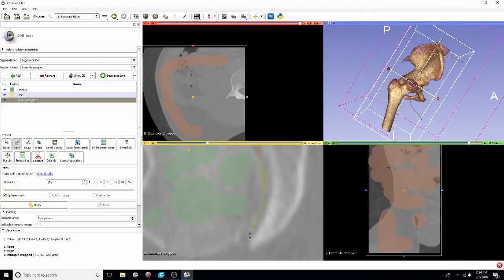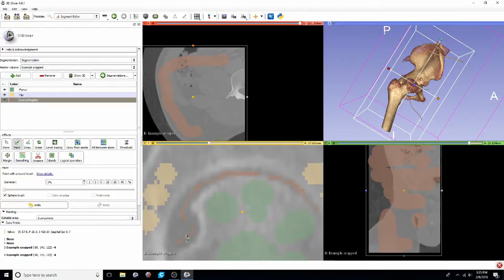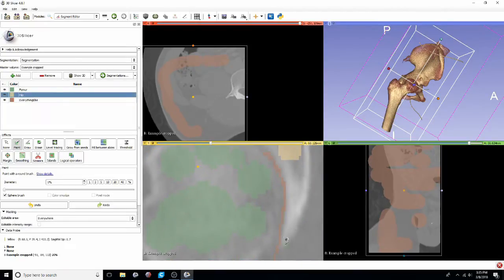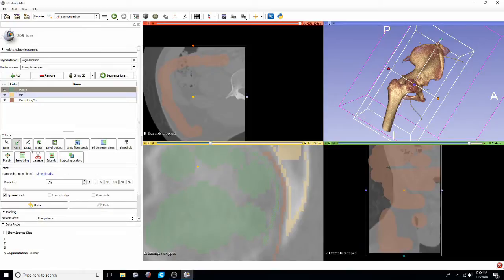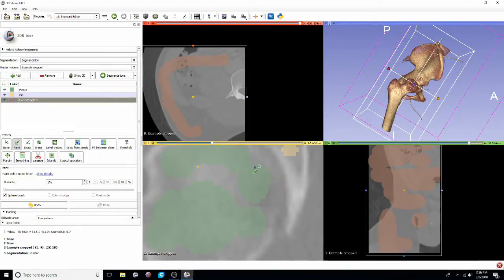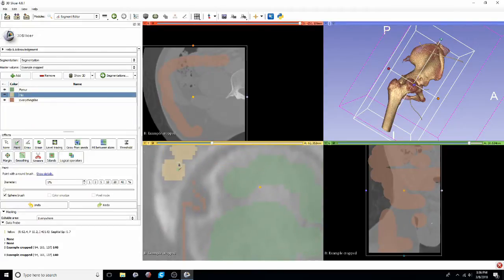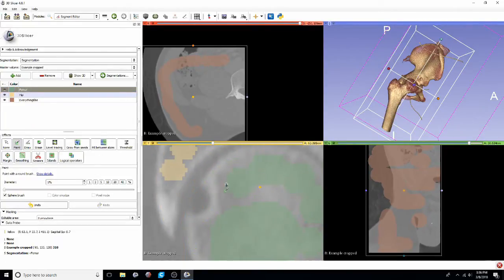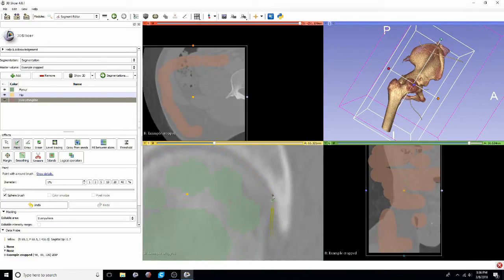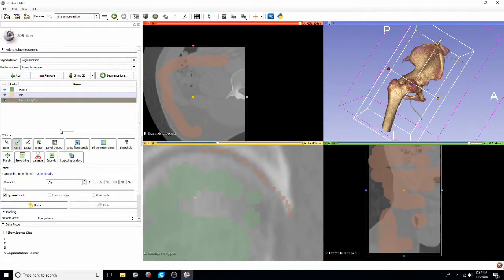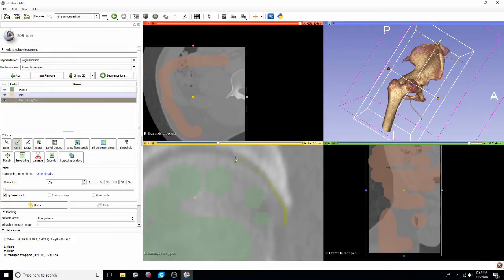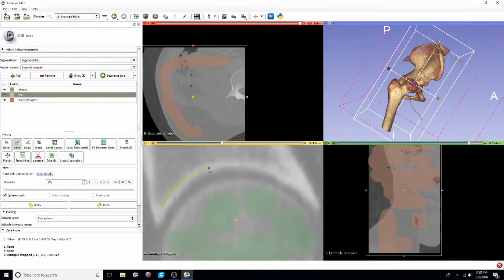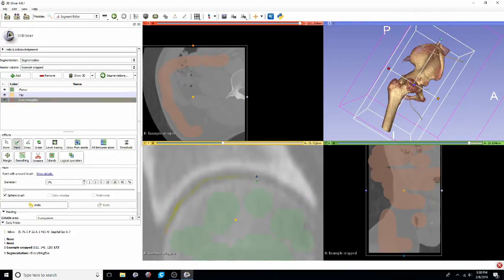This might be a bit of a time consuming process, but it's certainly faster than manually segmenting. And again, just the more data you give it on this first pass, the less editing you'll have to do later down the road. So it might actually save time. If you're wondering how to zoom in like I have on that yellow window, just right click and then drag down or up. That'll allow you to zoom in and out of that window.